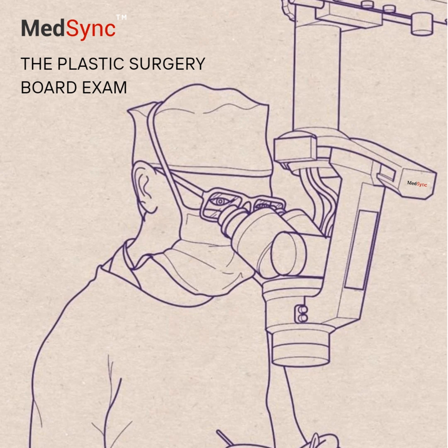Today we're focusing on negative pressure wound therapy, NPWT. That's right. Think of it as applying controlled suction to a sealed wound. Pretty much, yeah. A closed system under subatmospheric pressure. And our goal today is really to clarify how it works, how you apply it, and crucially, the indications and contraindications in surgical practice. Really key stuff for your board exams.